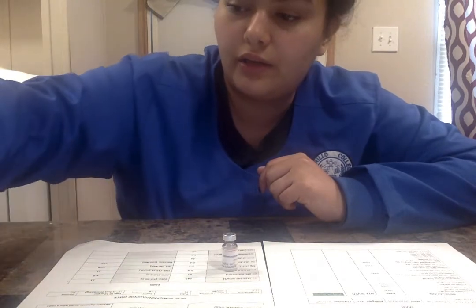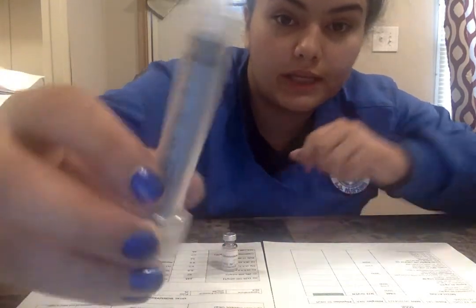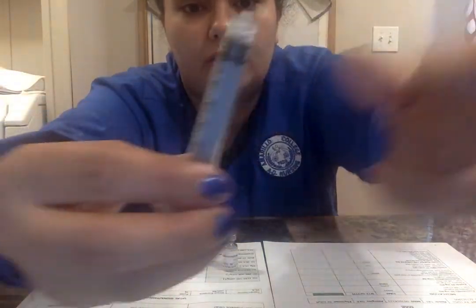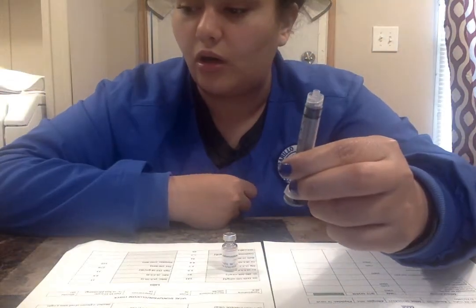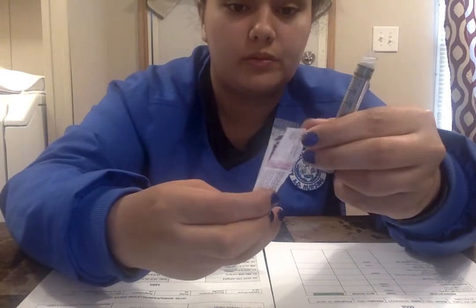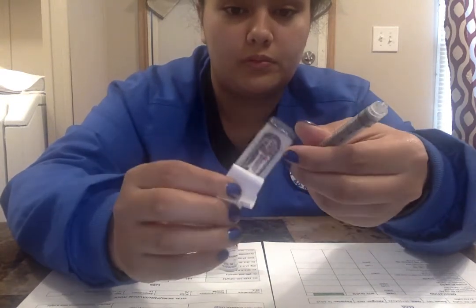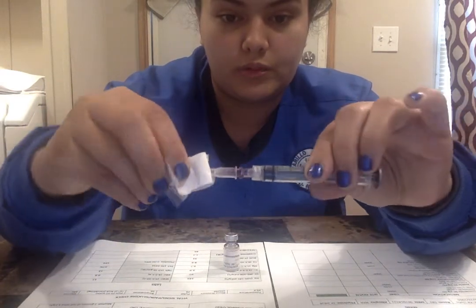We would get our 3 milliliter syringe. We would take it out of its container and make sure that it is a clean, sterile needle. We would grab our filtered needle. We would open the package. We would twist that in.